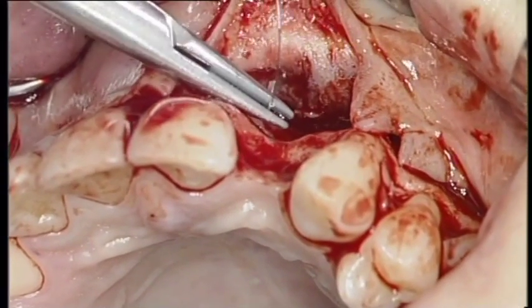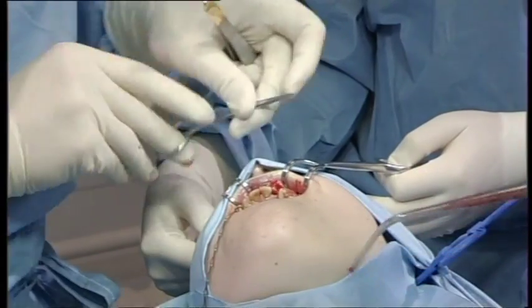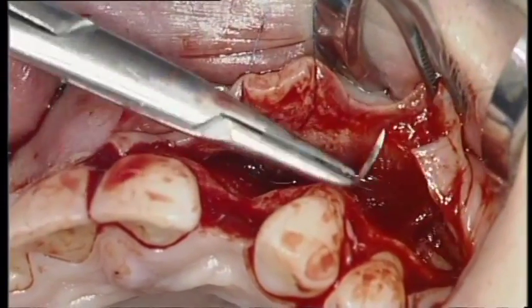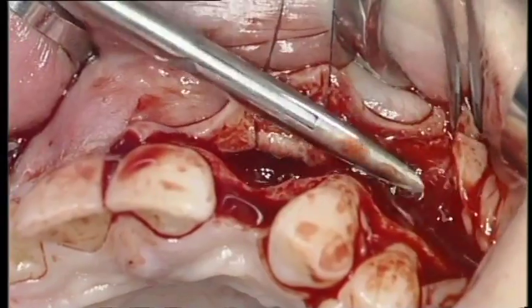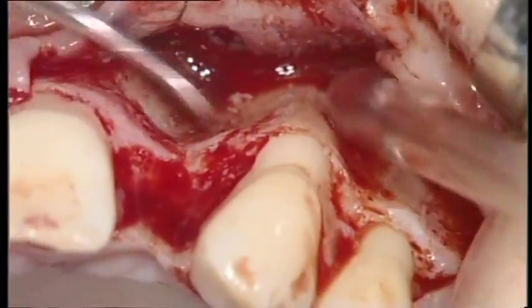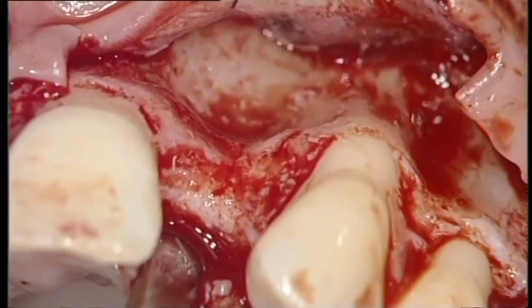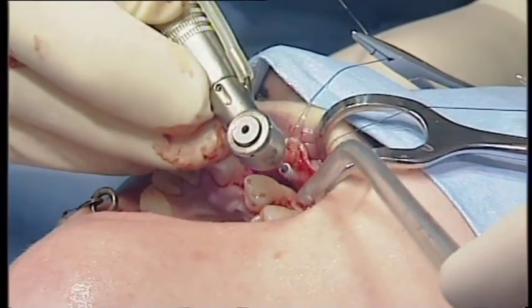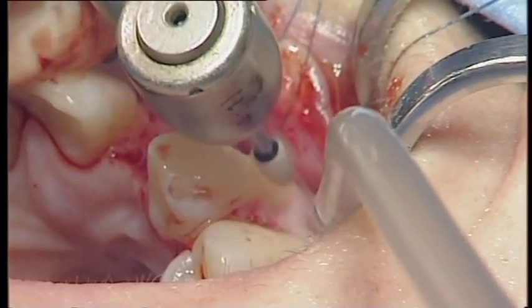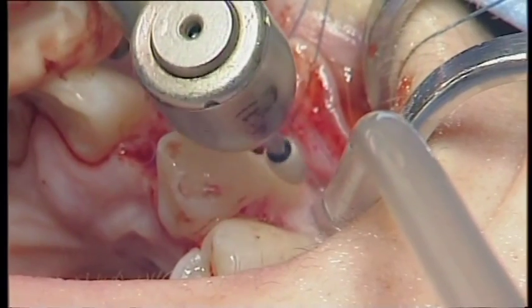Two retraction sutures are applied on the inside of the flap and attached to hemostats to ensure sufficient visibility and access to the surgical site. The debridement of the bone surface reconfirms the significant undercut on the facial aspect. Next, the root prominence of the canine is slightly reduced in volume using a fine white stone.